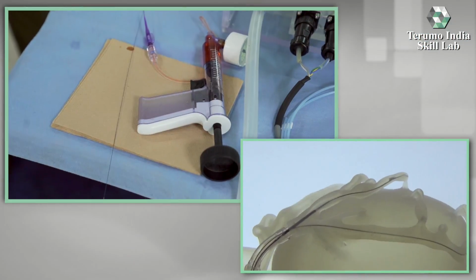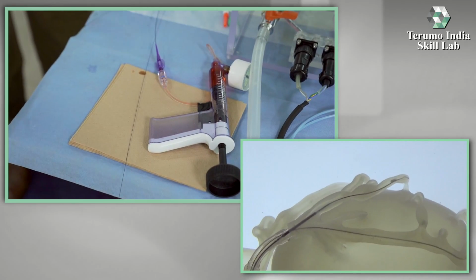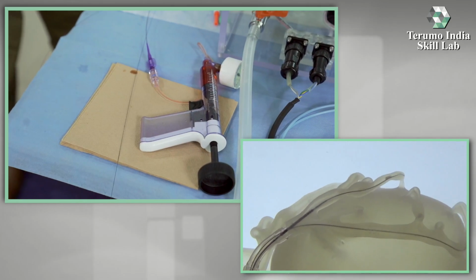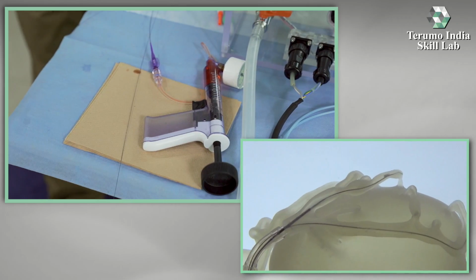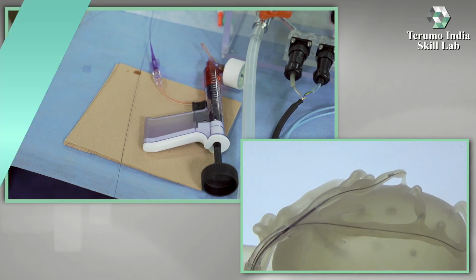We'll need a 3 mm NC balloon, 3 mm AccuForce, and a 3.5 mm AccuForce, both.